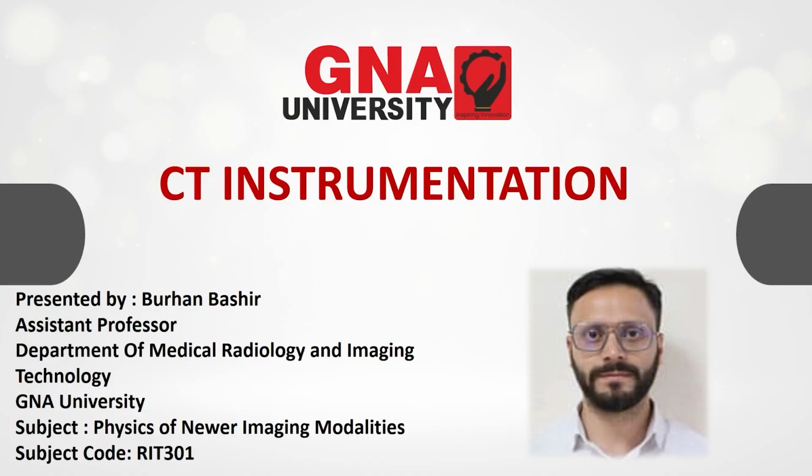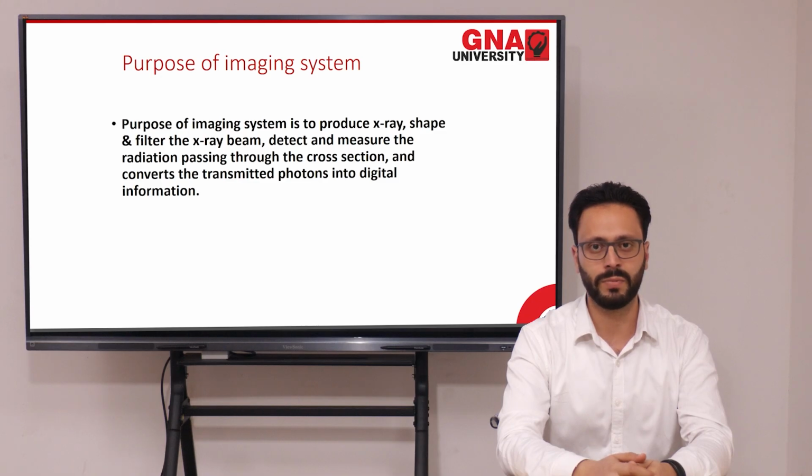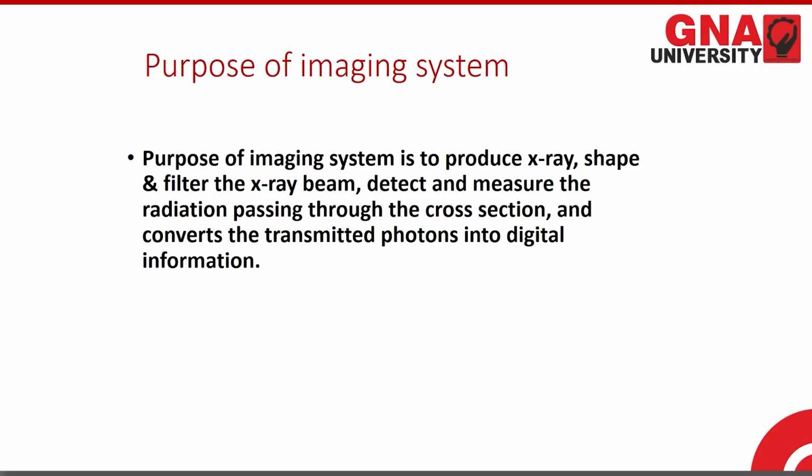So, continuing our topic with CT instrumentation, today we will be discussing the first half of the CT instrumentation that's known as the imaging system. So let's first try to understand what is the purpose of the imaging system.